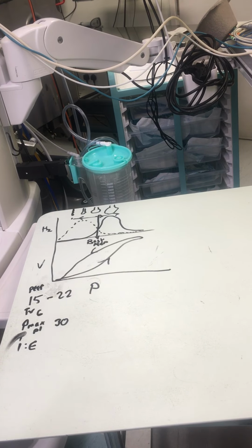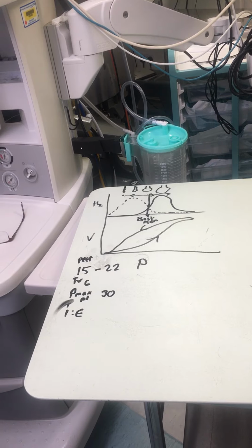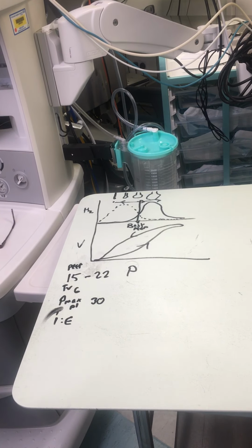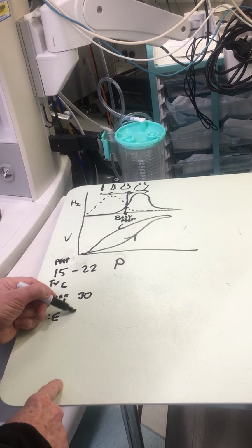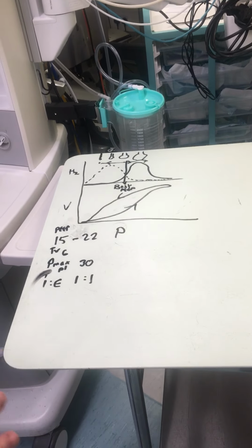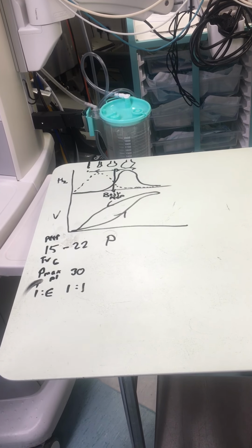They're not as stiff as we thought, but they are still somewhat stiff. They don't have airways obstruction. If they've got airways obstruction, COPD, asthma, then it's gas out, and then you need to lengthen up the E time. So IE ratio, where are you going to kick off? I would probably kick off at 1 to 1. It's kind of ballpark where we'd start from. So 1 to 1 IE ratio.